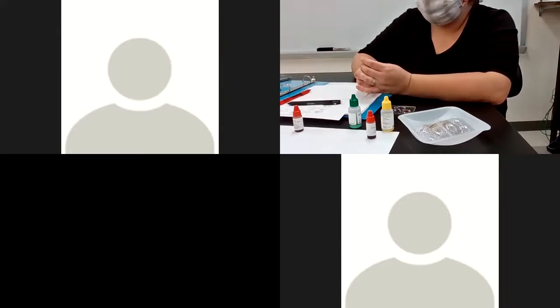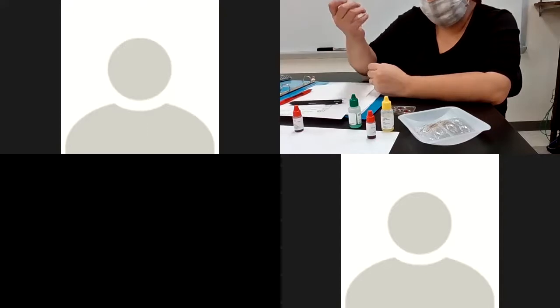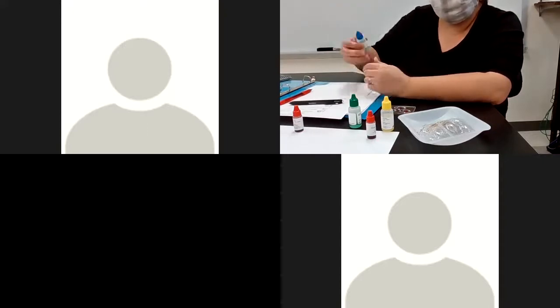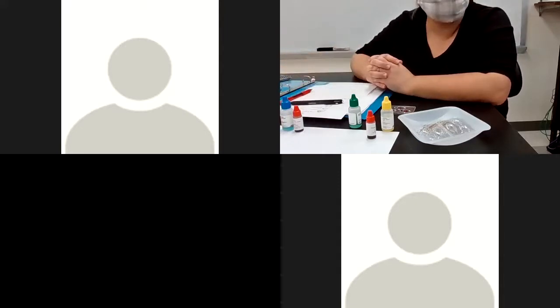And if they find it, I know genetically speaking, there's A antigen here. Okay, so drop in 4 or 5 drops of that. Make sure you put it just in the A well and it doesn't spill over. Okay, and don't tap the top into the blood because then you're contaminating it. How many drops? 4 or 5. You want to get a good enough sample that hopefully there's some goo to mix.